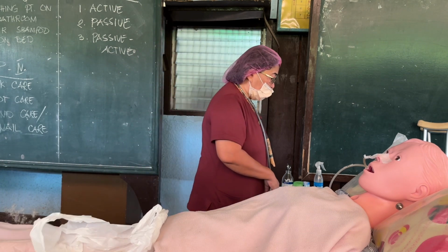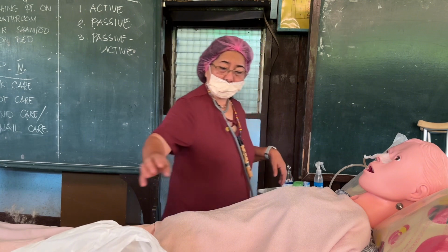Okay, so I'm going to loosen the plaster first.